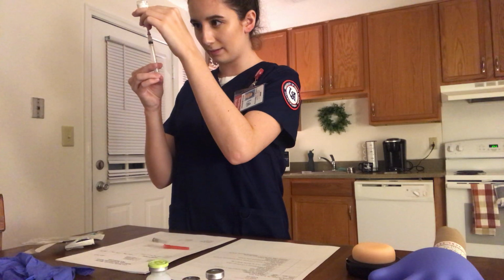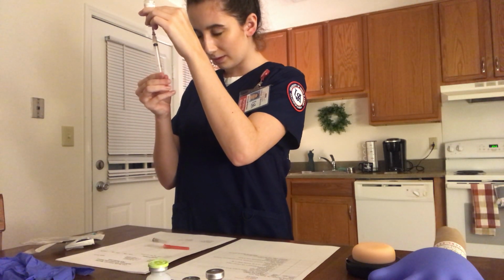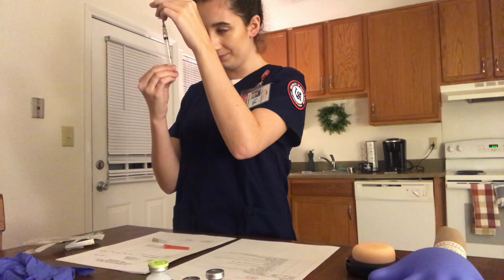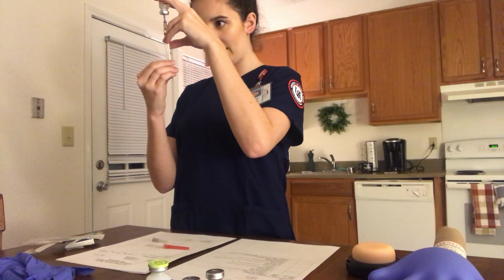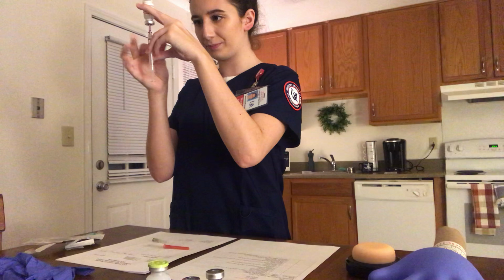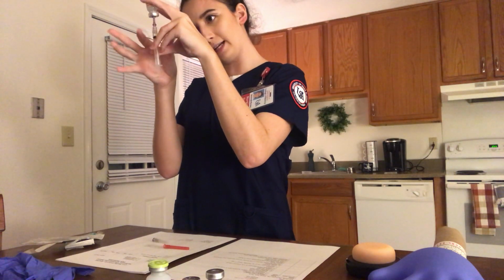We'll then take out the medication. You can take out more than half. When you are making sure you have no bubbles, you have the correct dosage.